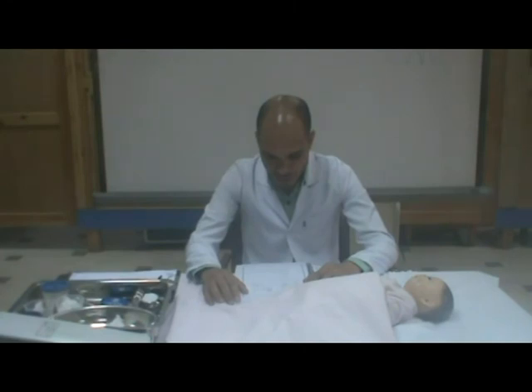The child should be quiet and relaxed during the performance of this procedure. Blood pressure is measured before any anxiety-provoking procedure is performed. Record limb position, cuff size and measurement, systolic value and diastolic pressure.